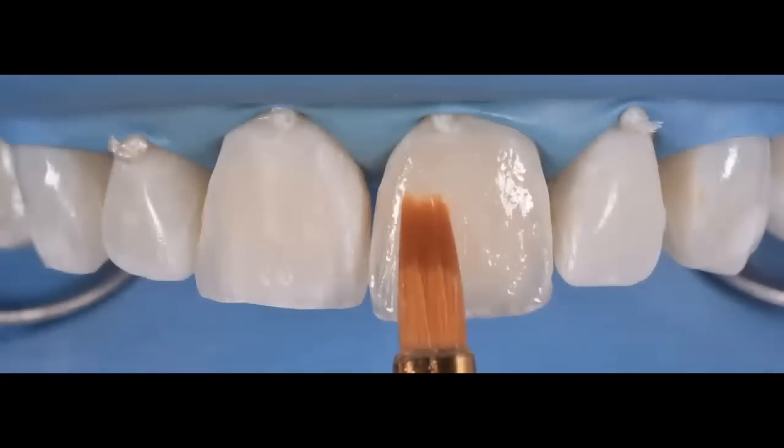Once we did that, we light cure that first layer of white opaque, and now we start placing a very thin layer of dentin. We're going to use a very light, high value dentin, a very thin layer, because again, there is not a whole bunch of room. You can see that I barely have some room to develop some line angles with my enamel. But just because I want to intensify the color and give it a little bit higher value, I added a very high value enamel, and I'm using this type of brush to go in and smooth that layer so that we eliminate any bubbles.